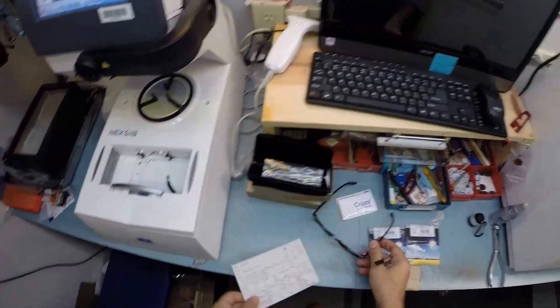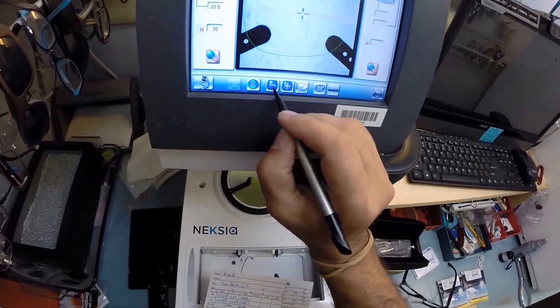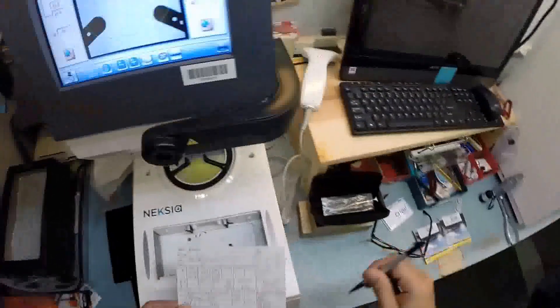So let me go ahead and type in your pupillary distance which is 31 in both eyes. It starts at 32.5 - I'm going to hit this little minus button a couple times until we're at 31.